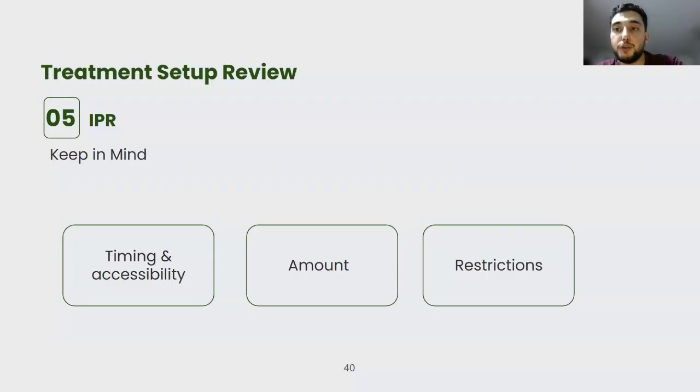A very useful tool to use in cases where the contact is not perfect between teeth, and I'm gonna need the space early on, I need the interproximal reduction, I can get something called one-sided interproximal strips. So these are strips that cut only from one side. So if I want to avoid cutting enamel from a certain tooth, but the contact is perfect on the other tooth, I can cut enamel from the right place I want. I can use these single-sided strips.